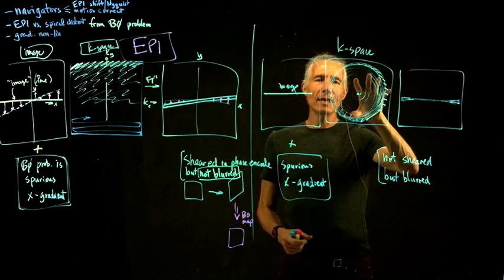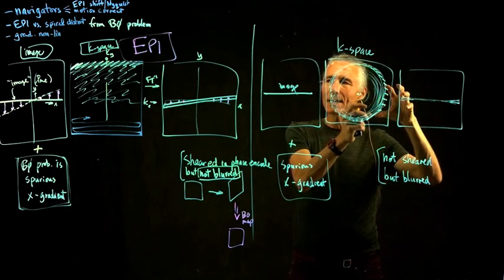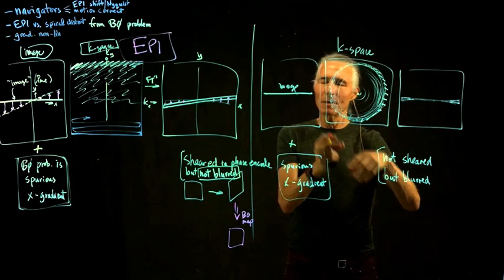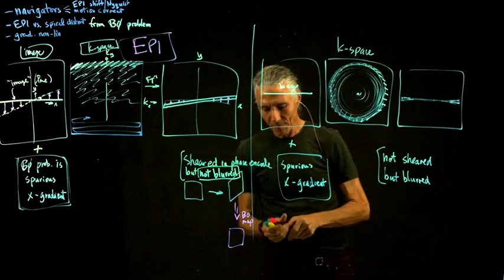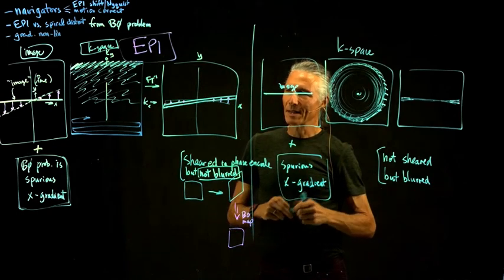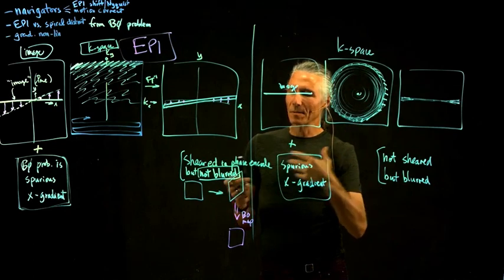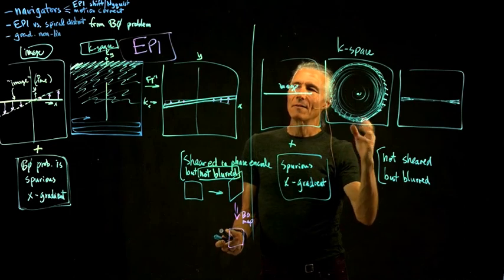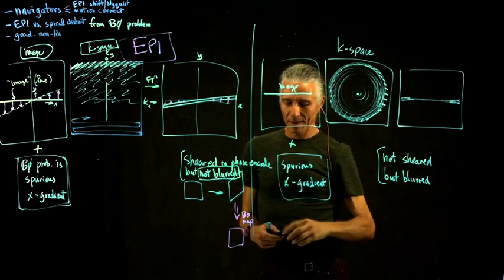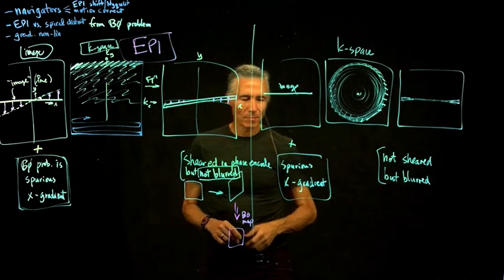It's a little more complicated because the error is building up. We have to go back into k-space and fiddle with the k-space data to correct the error that occurred as a result of this gradient in k-space. But conceptually, it's a very similar thing. But people have rarely set that up to do it. That's kind of a task for the future, to automatically collect a B0 scan when you're doing a spiral, and then use it to correct the spiral data to make it sharp again, because that would correct the blur in the spiral data.